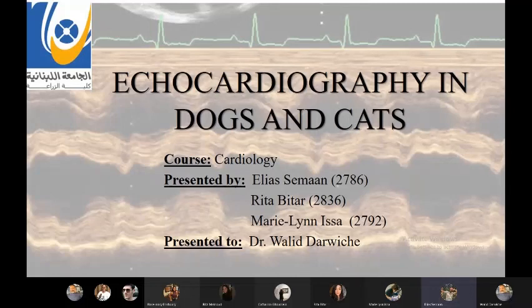Our main goal is to familiarize you with the basics of echocardiography, since we're all aware that echocardiography is a very wide topic and it cannot be discussed intensively with the time provided. Not to forget that echocardiography is a specialty by itself, so we hope to provide you with the essential information.